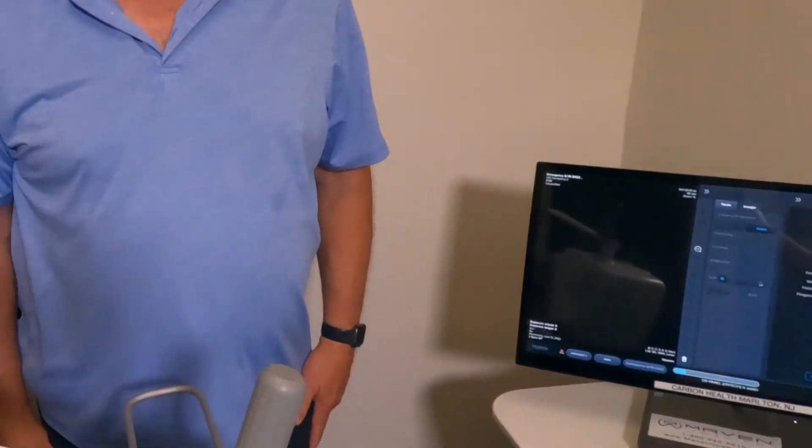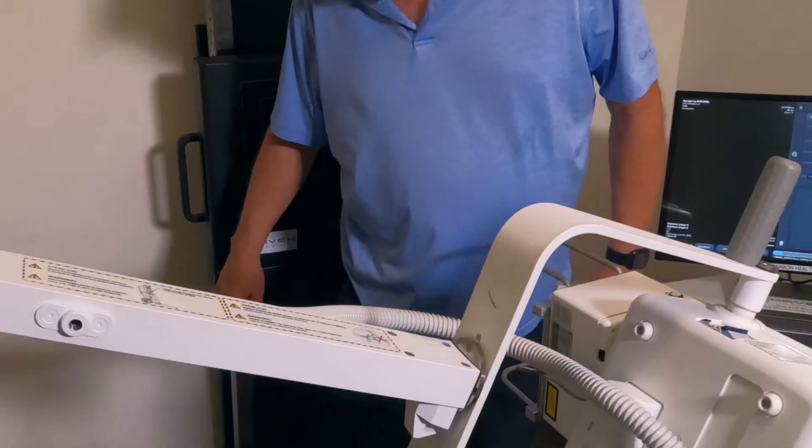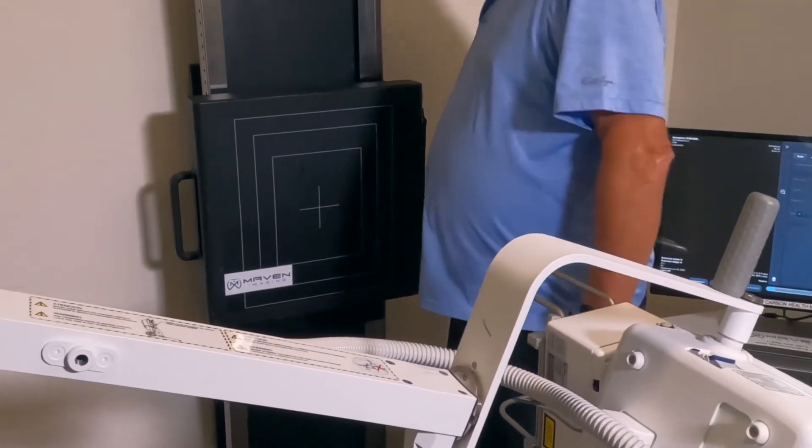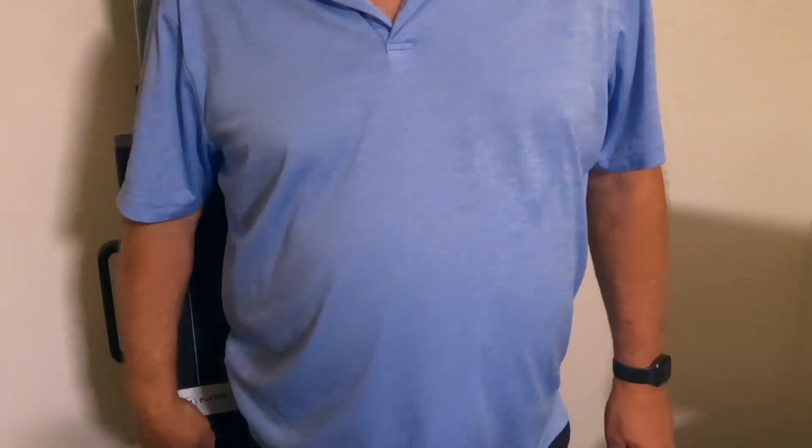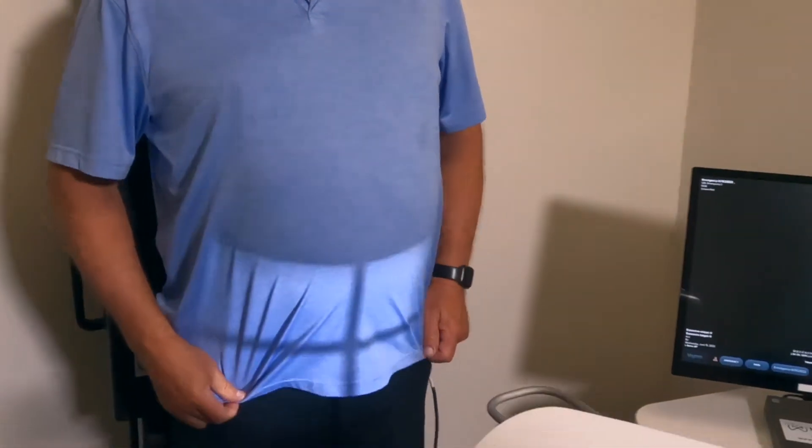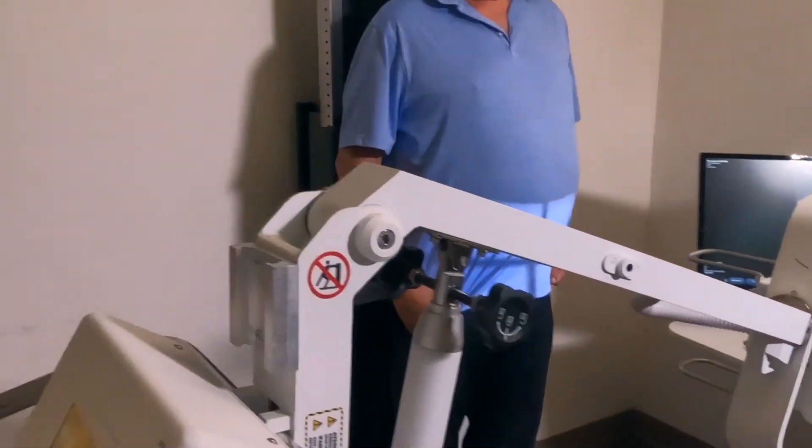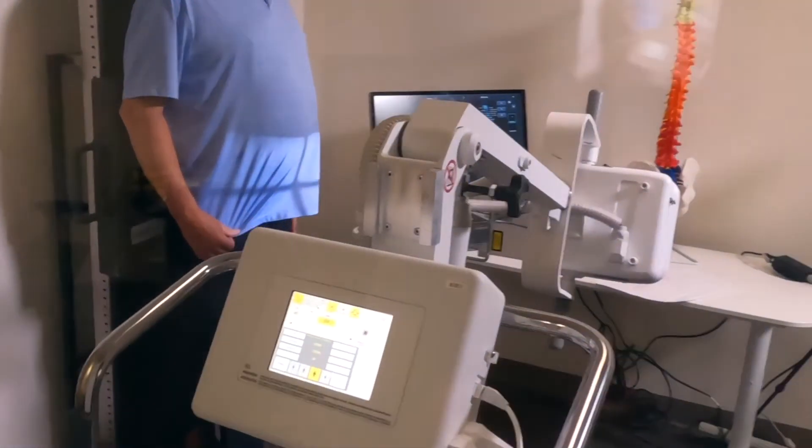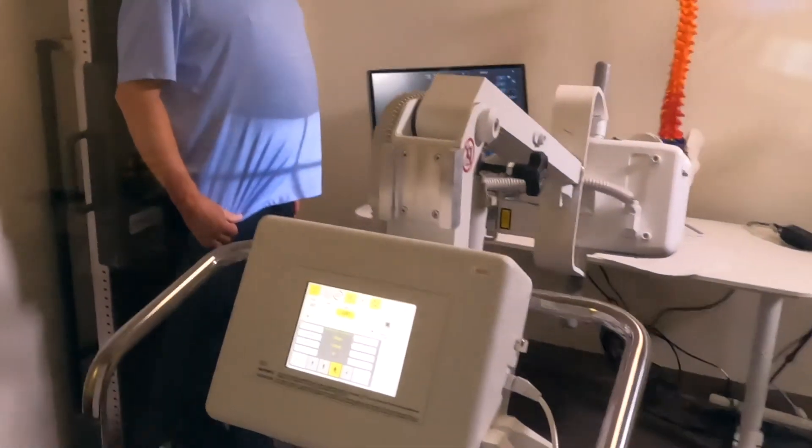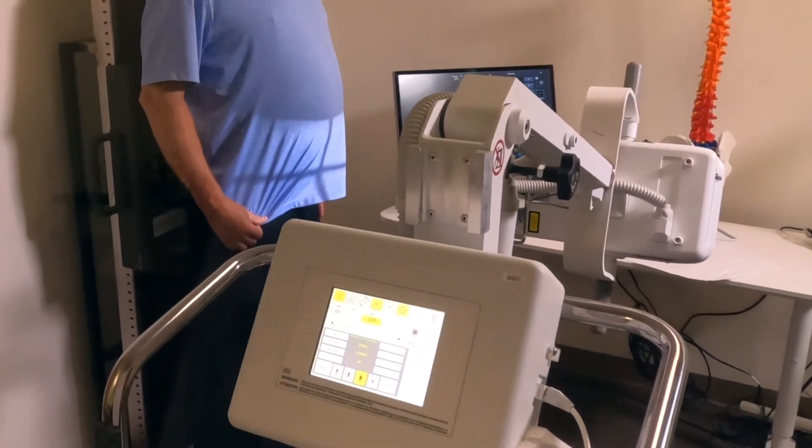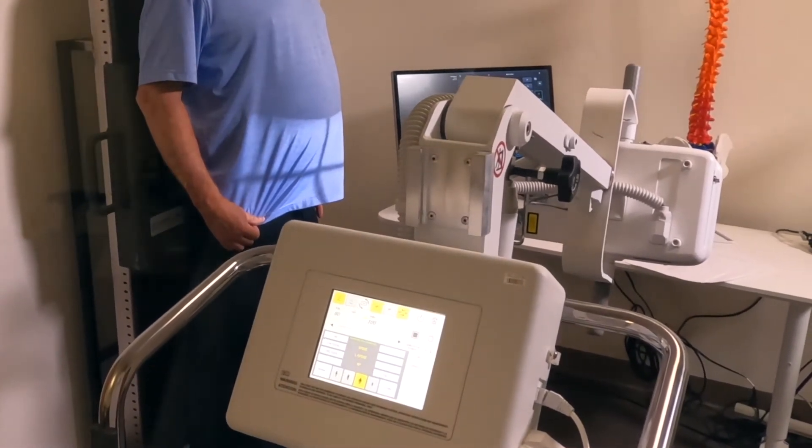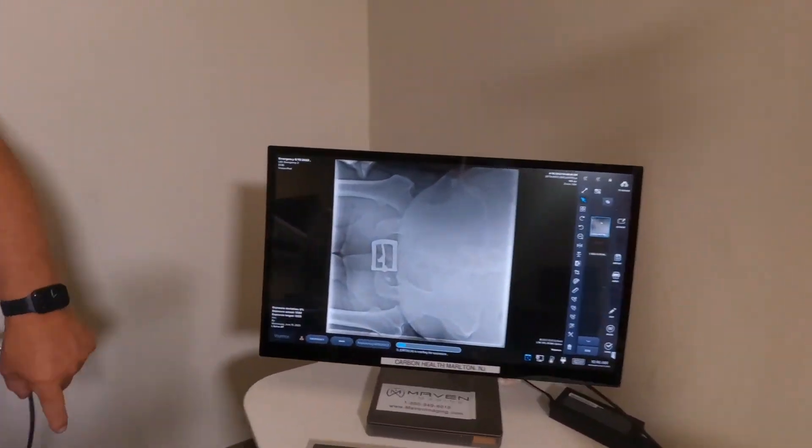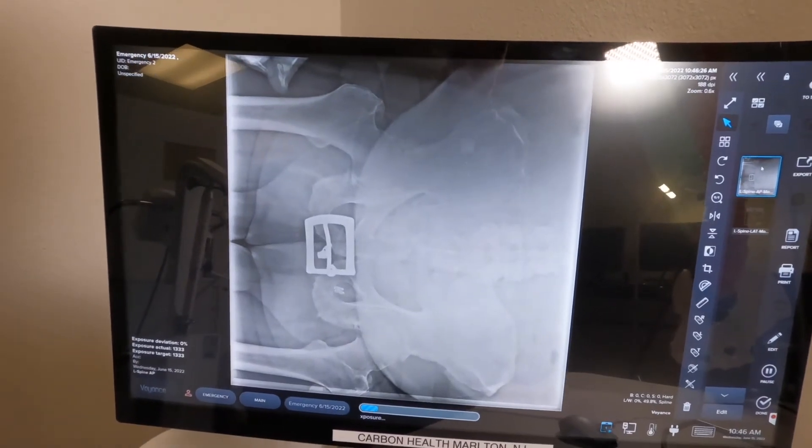We come over to our Voyance software and click on AP and lateral. The first shot we're going to do is shoot an AP shot. I'm going to position myself on the DR panel. You're going to see on the screen—you're now going to take an AP shot and hold down on the button until you hear the beep.